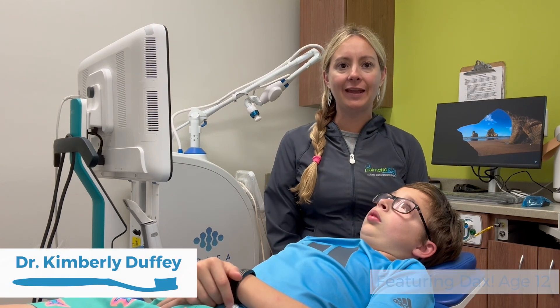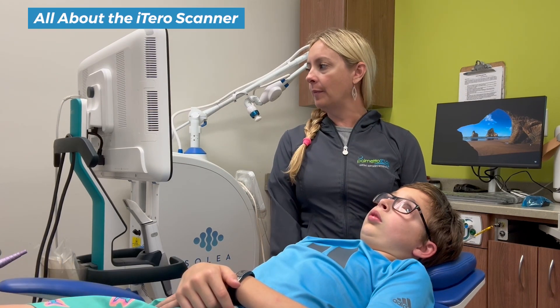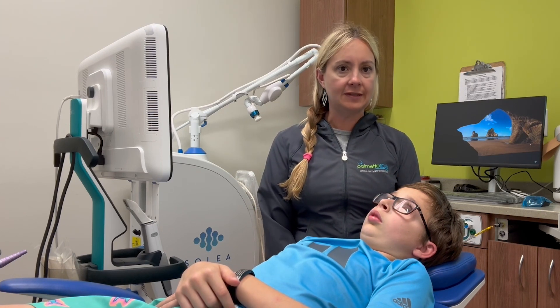Hello, it's Dr. Kimberly. We are here today to talk about a new scanner that we have. I wanted to show you how we use it and then I'm going to cut into a video so you can actually see the screen.